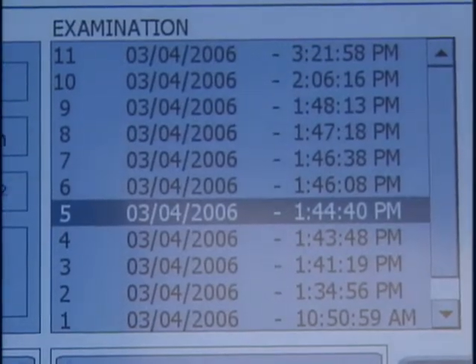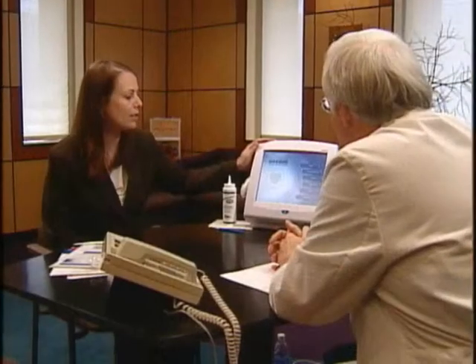This monitor can be used in all sorts of clinical environments, and it can be used on patients from neonates all the way to geriatrics. Okay, let me give you a brief demonstration of the USCOM.